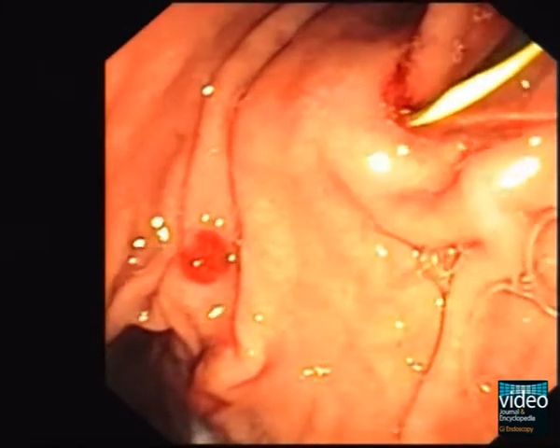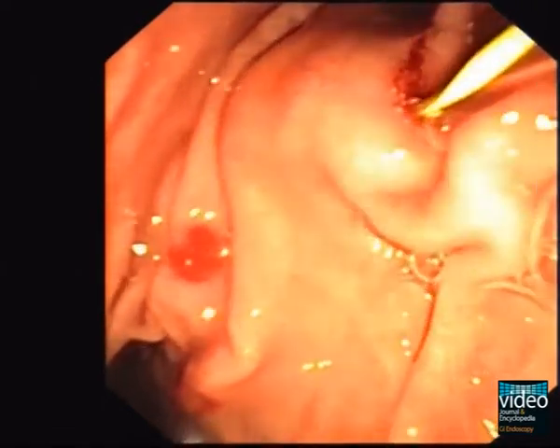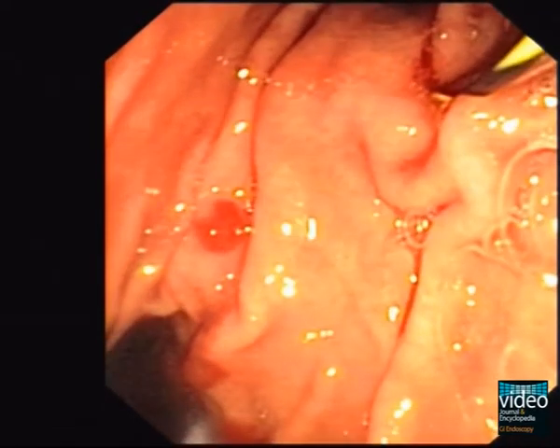Under EUS guidance, a 0.035-inch guidewire is inserted through the needle into the duct directly to the tail of the pancreas. The guidewire should be introduced as far as possible to achieve a stable position for the next steps.